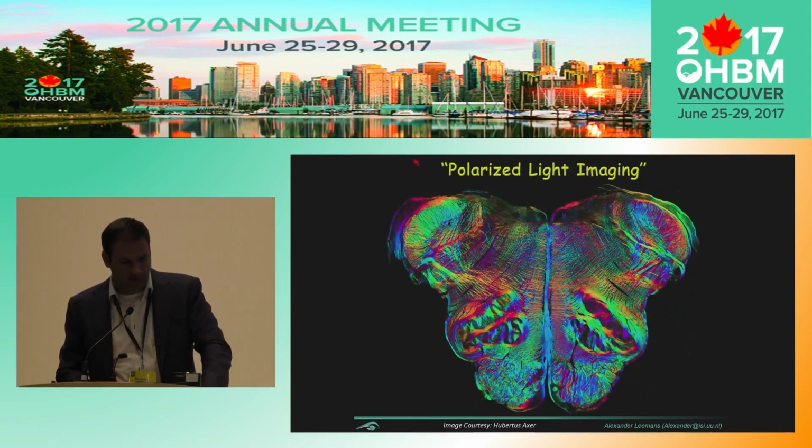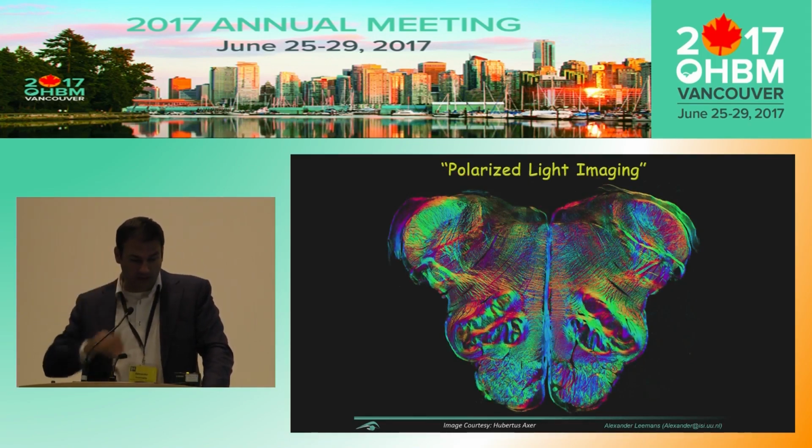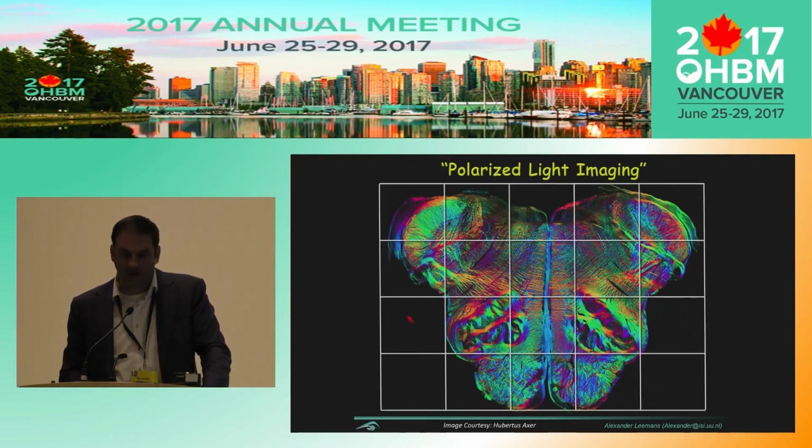And if you don't believe me, here's a polarized light imaging microscopy image. So this is near the medulla oblongata, so just below the brainstem. Okay, obviously this is ex vivo. Otherwise diffusion MRI would be out of business, because this is a resolution which is extremely high, right? If I overlay our diffusion resolution, we'll get something like this.